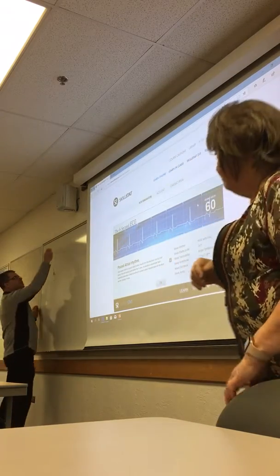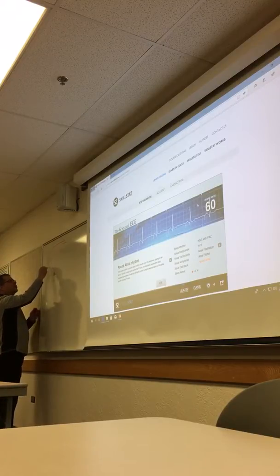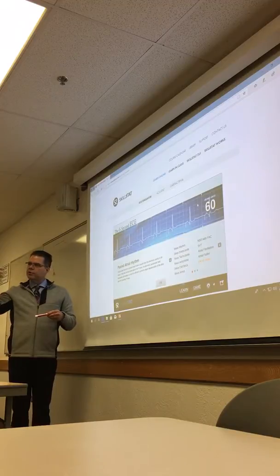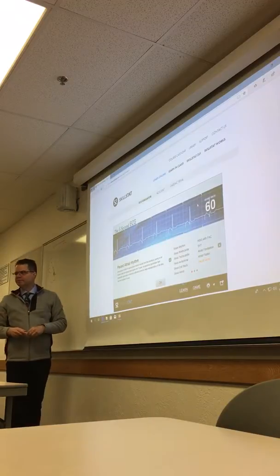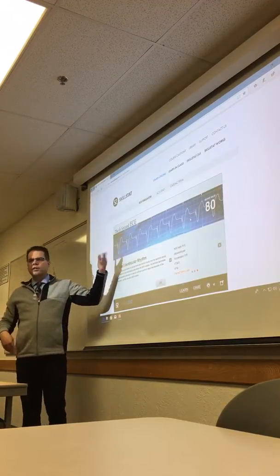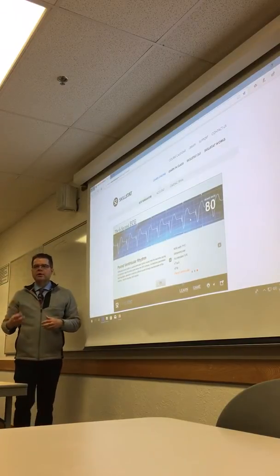If I have a pacer box, usually it starts off on my left side, and the wire will go through and they'll embed it somewhere here in the atrium. It actually looks like a corkscrew, and they just stick it right in there, the tissue grows over it, gives it a good contact, and that tells me that it's embedded in the atrium. Do you want it to look like that when they have a pacemaker? Yeah, that's it. Now, some of them are on-demand pacemakers, so you might see this occasionally, and then it drops, and then it comes back, and it's only needed when the heart and the SA node can't work.